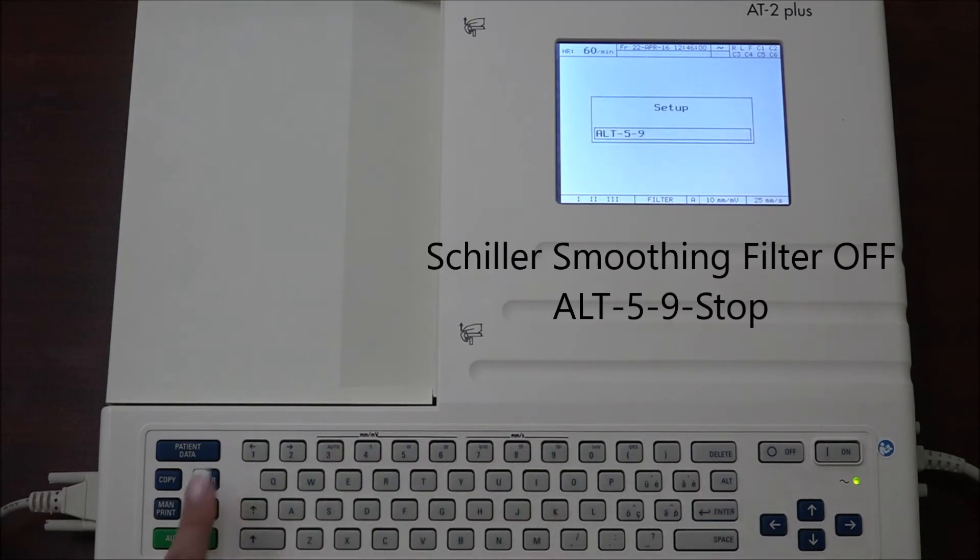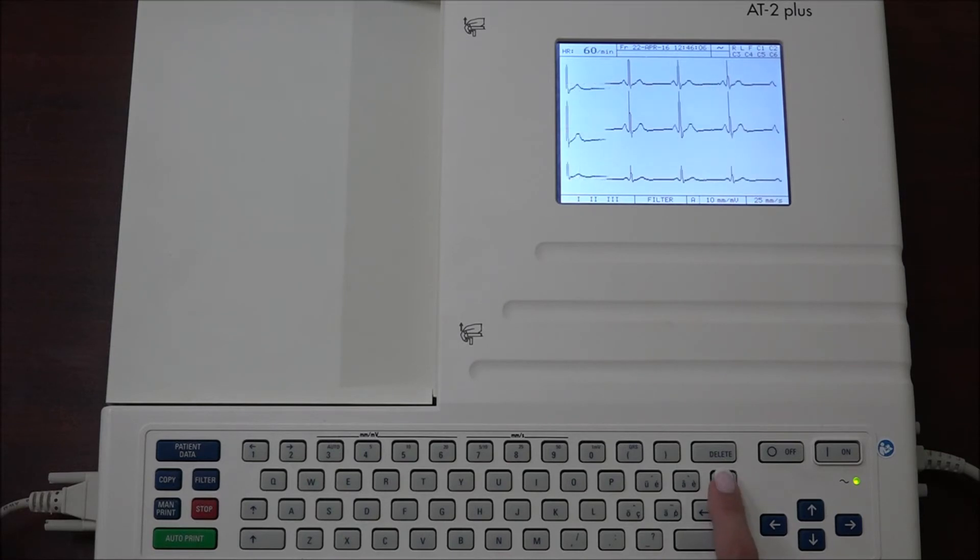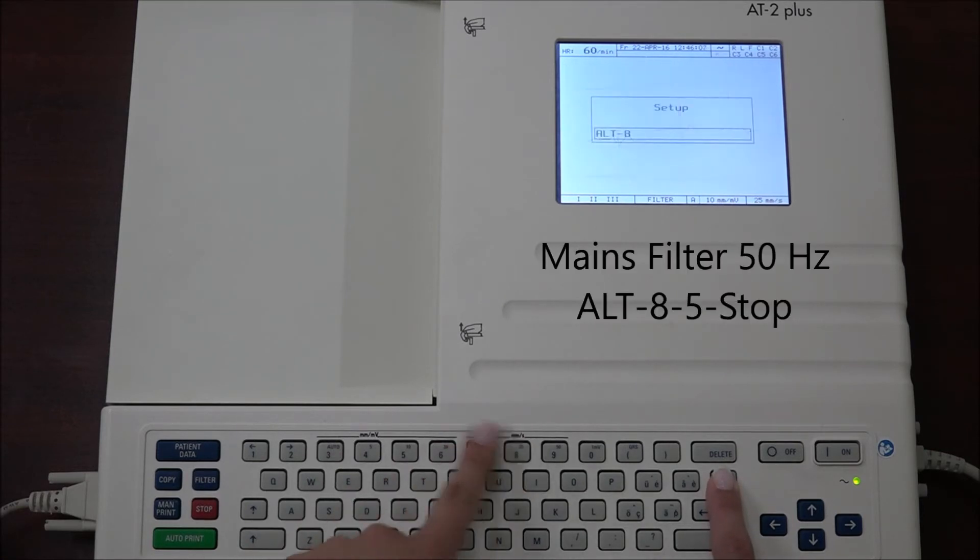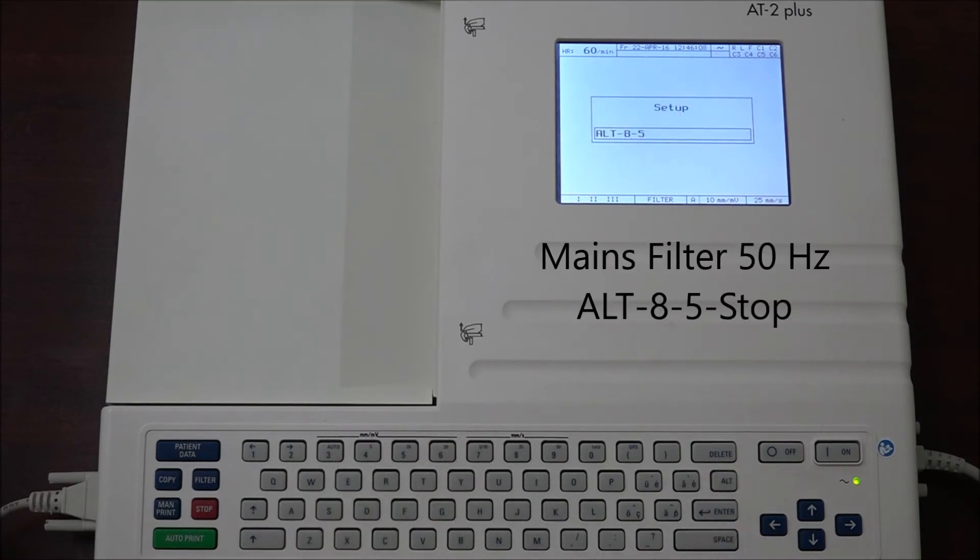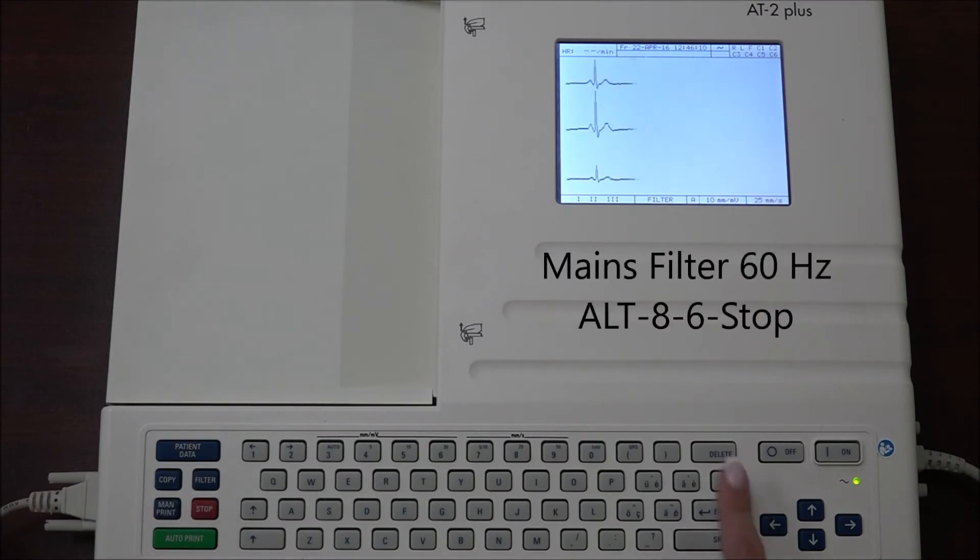The frequency of the mains filter can be adjusted using the following codes. To set the mains filter to 50 Hertz, press ALT 8 5 stop. To set the mains filter to 60 Hertz, press ALT 8 6 stop.